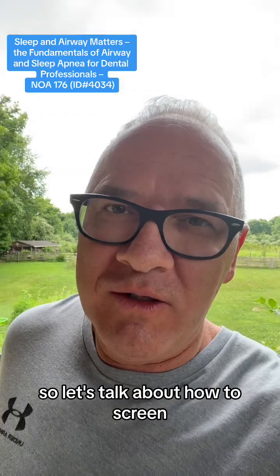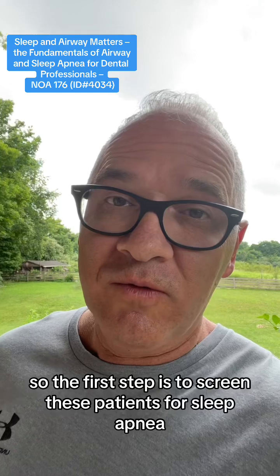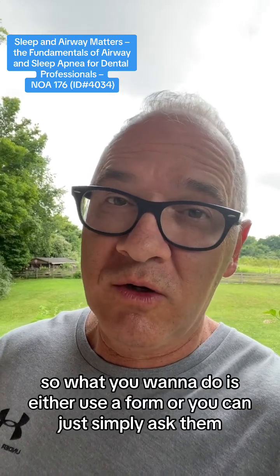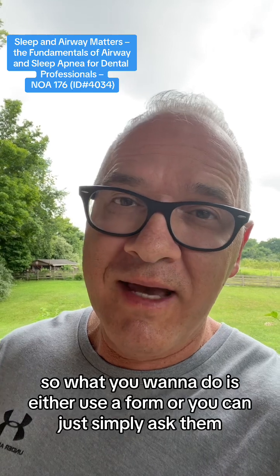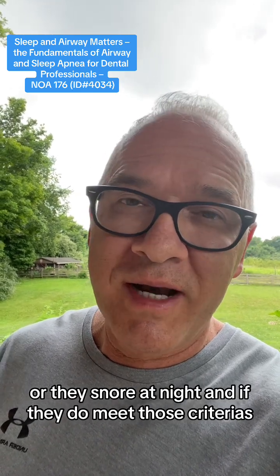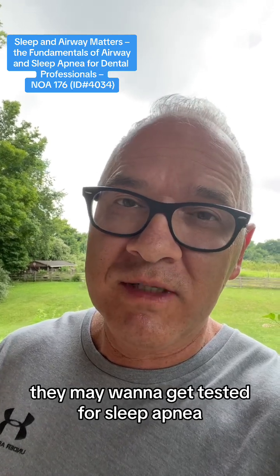So let's talk about how to screen as well as treat your dental patients with sleep apnea. The first step is to screen these patients for sleep apnea. What you want to do is either use a form or you can simply ask them. You can ask them if they feel worn down and tired during the day or if they snore at night. And if they do meet those criteria, they may want to get tested for sleep apnea.